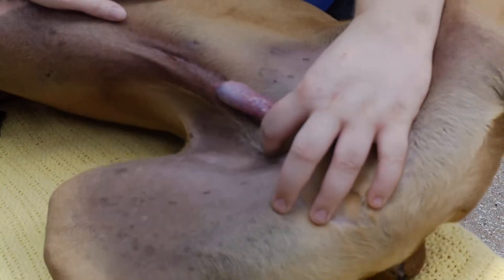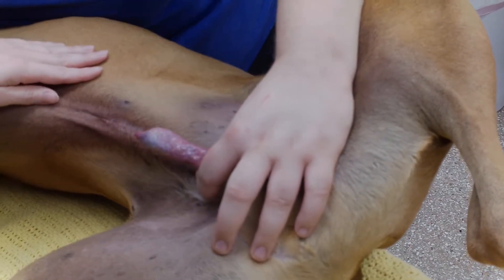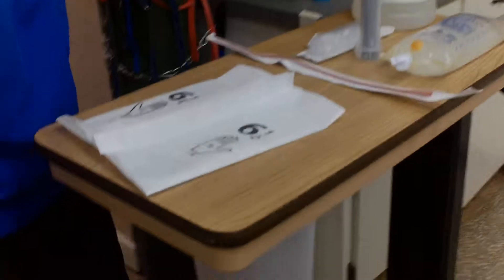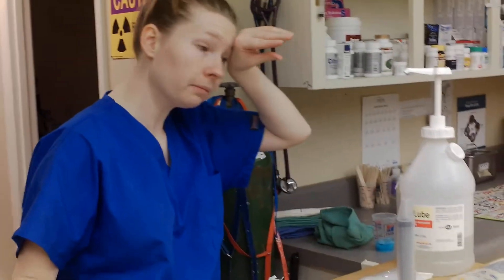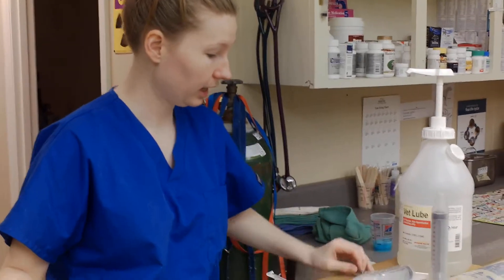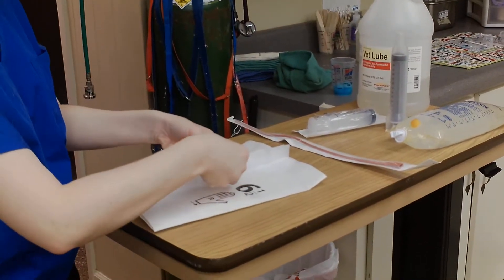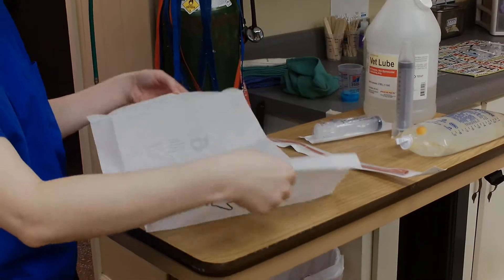So what we would do — we've got him scrubbed up. We're going to go with that, just to show you how we do that. As far as my supplies go, I'm going to do similar to what I did with the male urinary catheter. I'm going to go ahead and open up my gloves. At this point I would scrub in and have my gloves ready.